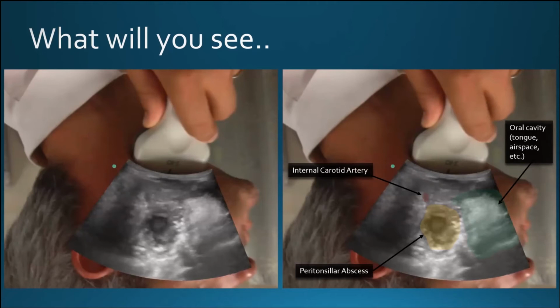structure that's going to be just medial to the oropharyngeal cavity, which is going to be this hyperechoic structure that you're going to be seeing here. This is the tongue, this is the airspace, and then I just highlighted everything over here for visual purposes. So you can see the abscess over here. You've got your oropharyngeal cavity, and then you have your internal carotid artery right there, which is probably less than maybe half a centimeter.